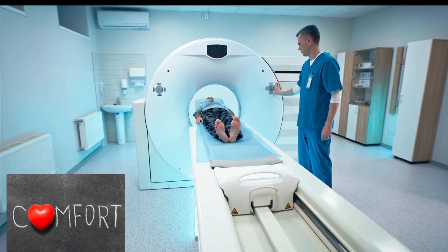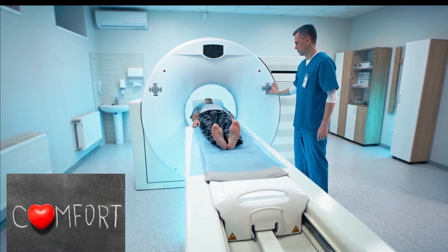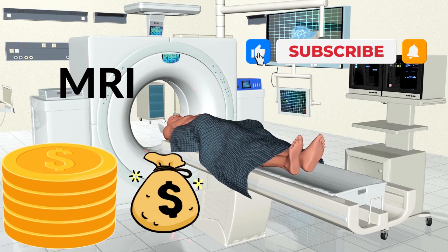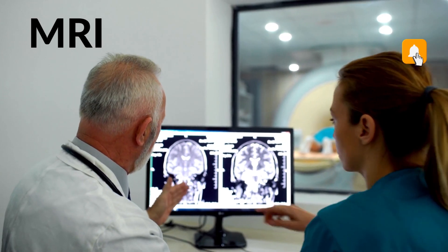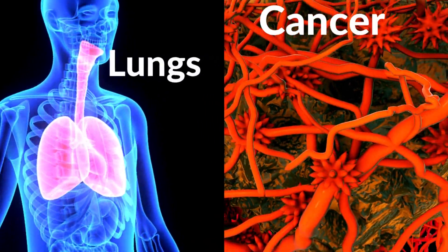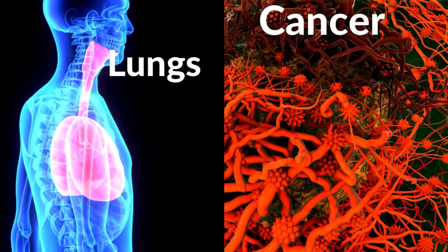Differences between MRI and CT scans: CT scans may be quieter and more comfortable. MRIs are typically more expensive than CT scans. MRIs can show more detail than CT scans. CT scans are more often used to assess bone injuries, problems in the lungs, or for cancer-related issues.